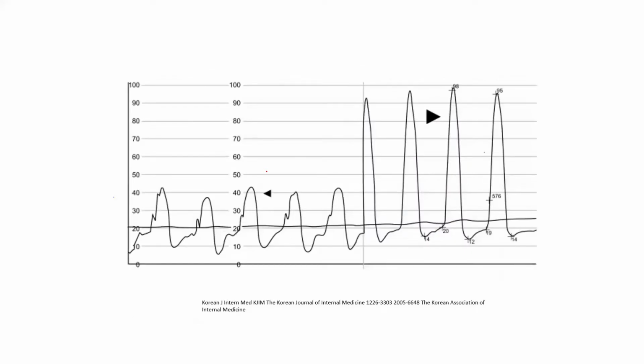Now, what is this? Somebody in the cath lab is negotiating the left main, and this happens, and then he does something, and the second part happens. So what is this? This is ventricularization, and damping. Because it's not only ventricularized, but damped. The pressure has decreased. So this is damping and ventricularization.